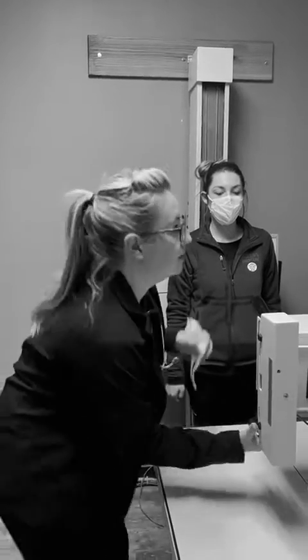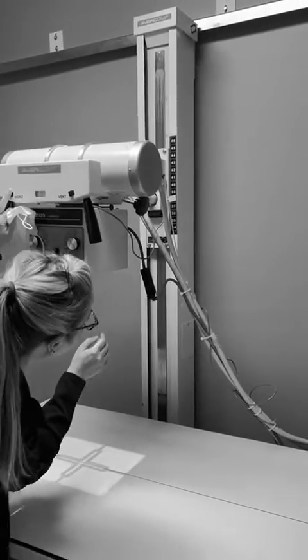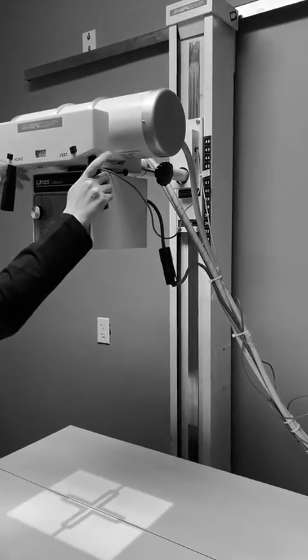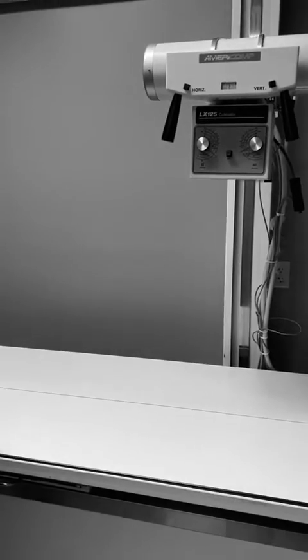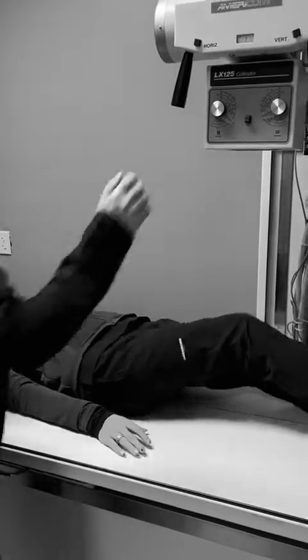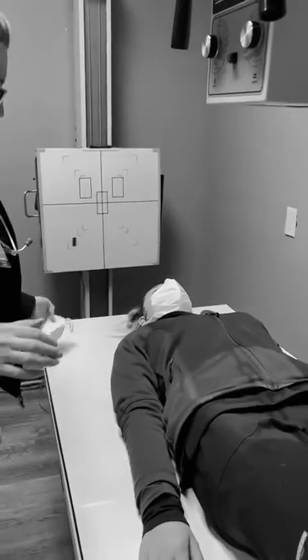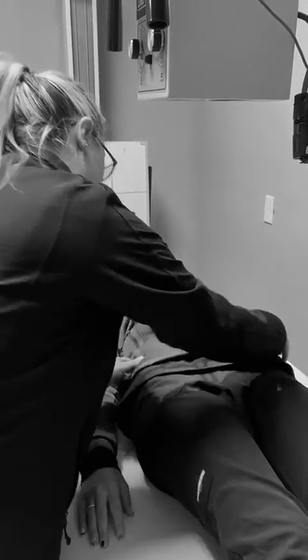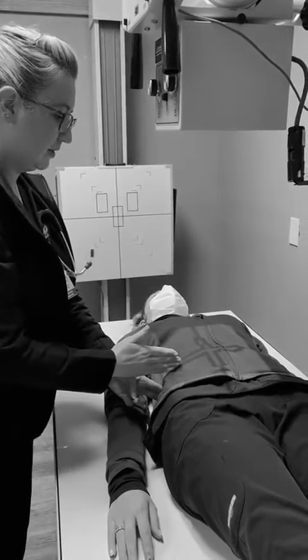Now we're going to have her move over to the table. We're going to raise the cassette, and we want it at 40 at the cassette. Bring it down here. We're going to have your head up here, feet down there — and just down a little bit for the side. Bring this up, same thing again, and then we're going to try to find the crest. Press in on the top of the hips there. That's going to be the iliac crest at the top of the hips.